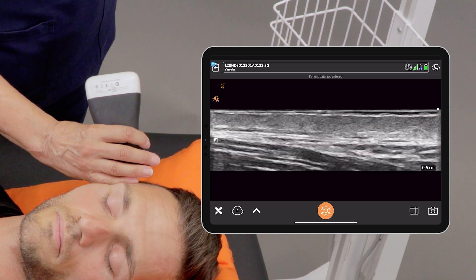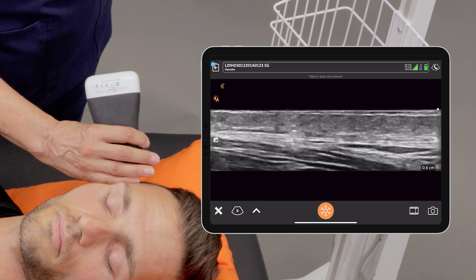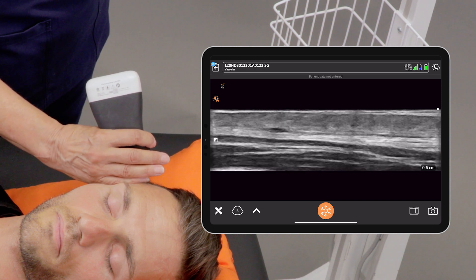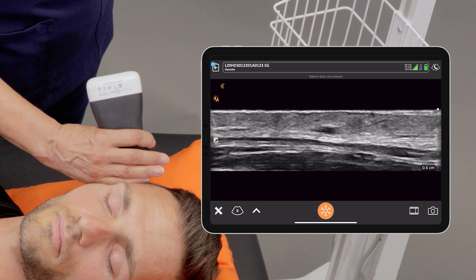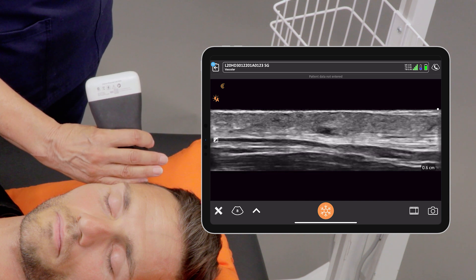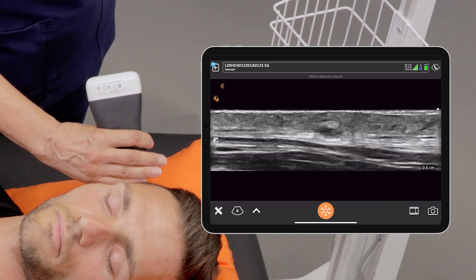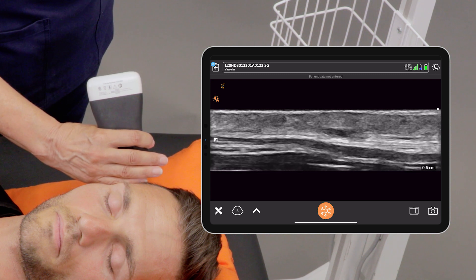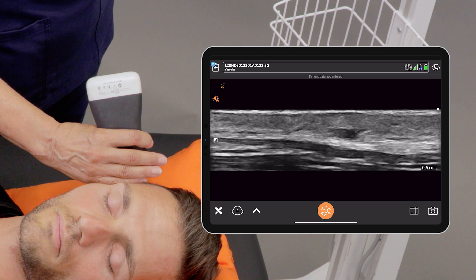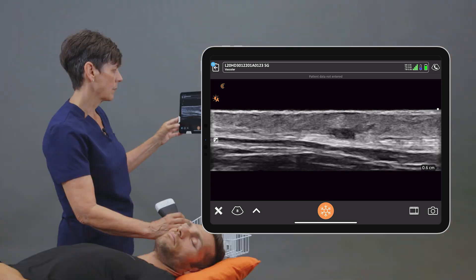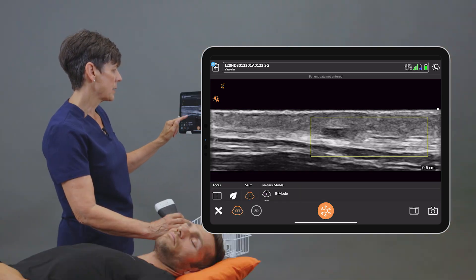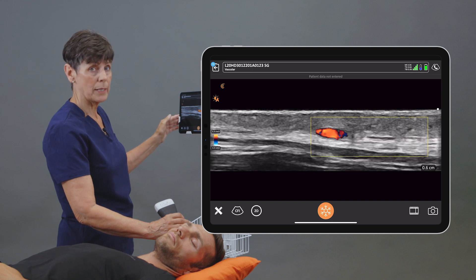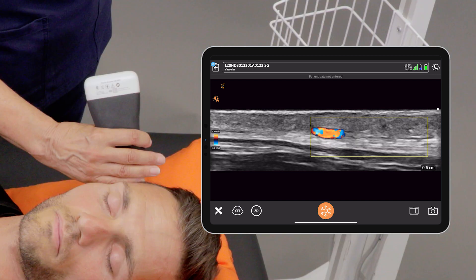I have a very superficial setting here and I'm going to look for that very tiny artery. We can see the vessel here, and in cases of arteritis we would see an enlarged vessel, edema of the wall. Color Doppler is sometimes helpful for evaluating the lumen of the vessel.